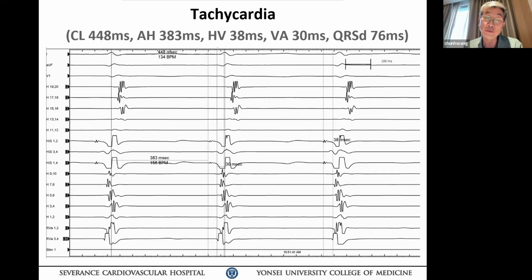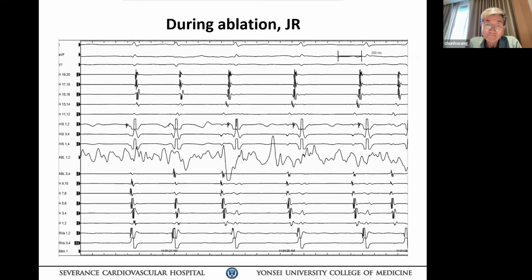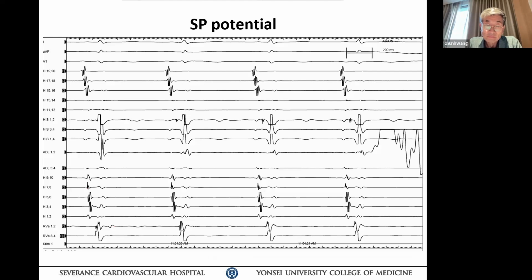Some patients, you're going to be inside the CS. That may be involved with the mechanism of tachycardia. That also can suggest the tachycardia target site you're going to ablate. Okay? Now you go to the ablation signal. So you had the ablation signal here.